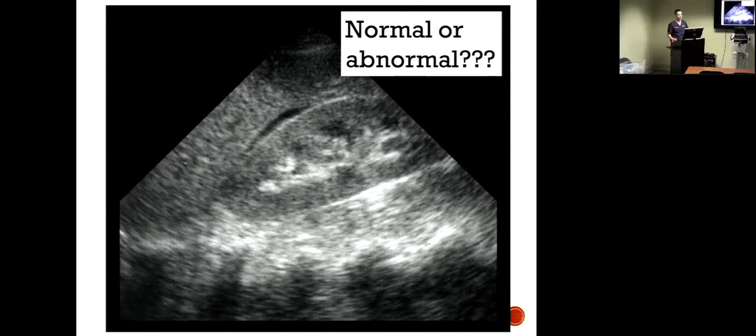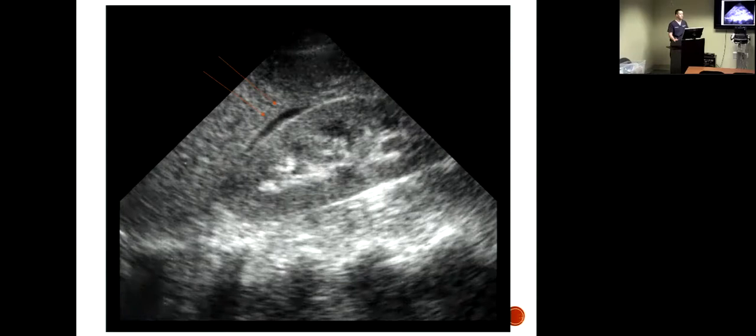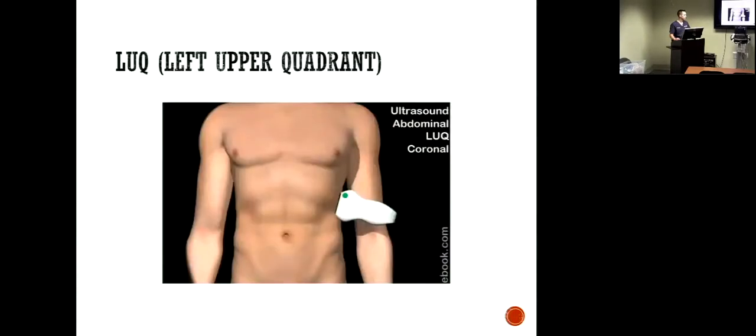Would you call that abnormal? Yeah. Now, how would you estimate, would you want that to be greater than 250? That's a good question. We can't. Again, we're just saying fluid, no fluid. And you need at least 250. So sometimes you have a GSW victim, they haven't accumulated enough blood. You look and it looks negative, but you just don't have enough fluid at that moment. If you maybe waited 10 more minutes, put it back on, big positive. So it's a static exam at that moment. But yeah, good question. You can't really know how much fluid's in there.